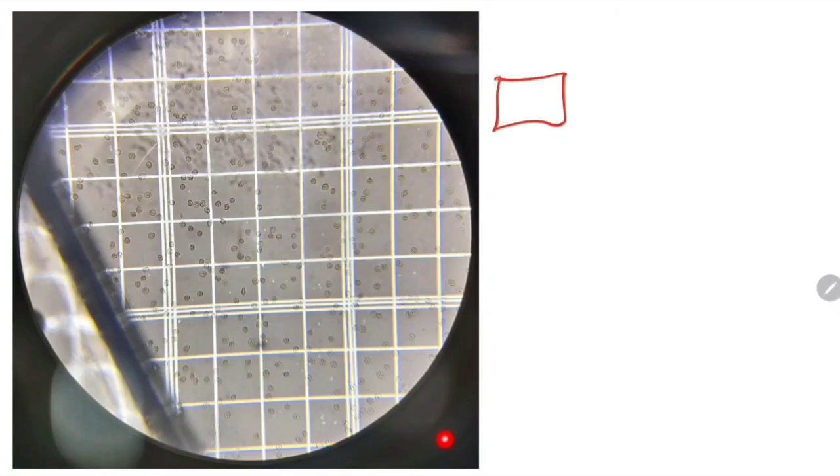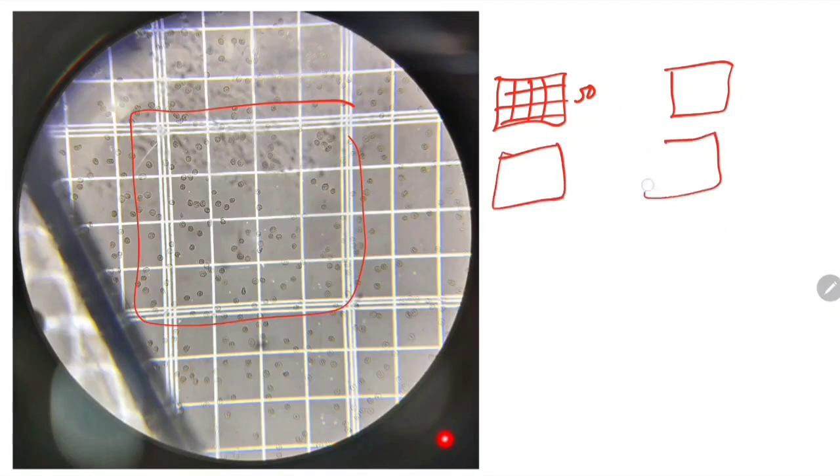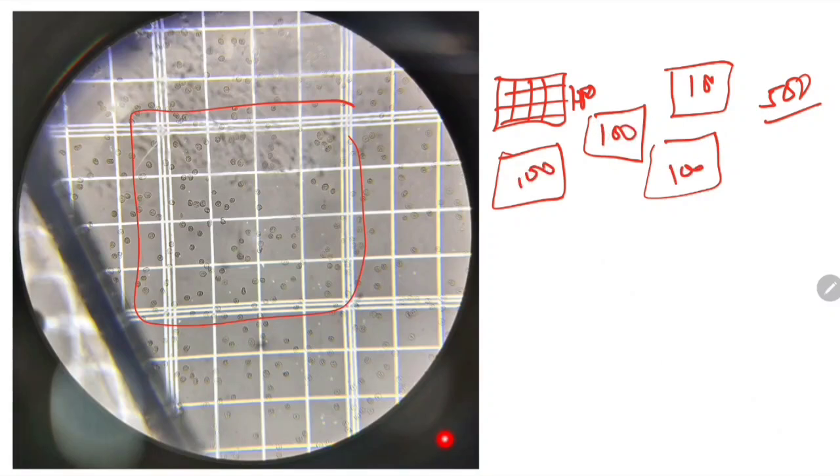Now we are clear. This is one box, and in one box we have multiple cells, and the total number is, suppose, 50. Next we have another box, then another box, and then one more box. So 50, 50, and the total number, suppose you are getting 500. Suppose 1 2 3 4 5, suppose this is 100, 100, 100, and the total number will be 1 2 3 4 5.